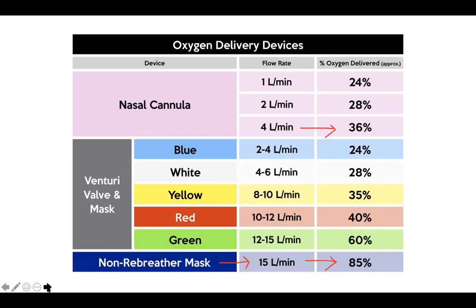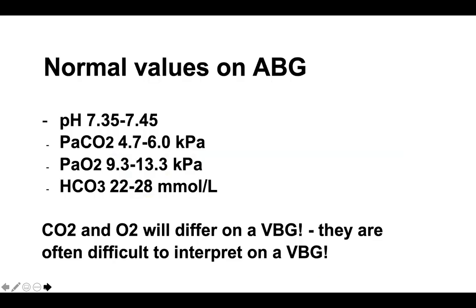Sorry, Eurus, it's particularly important because once you're looking at your oxygen levels, your carbon dioxide levels, your pH on the ABG strip, it's very different if a patient's on 15 liters of oxygen as opposed to only on 1 or 2 liters of oxygen. So it's just really useful to have that in your mind's eye and run through the interpretation steps. Thanks. You go on to the next one.